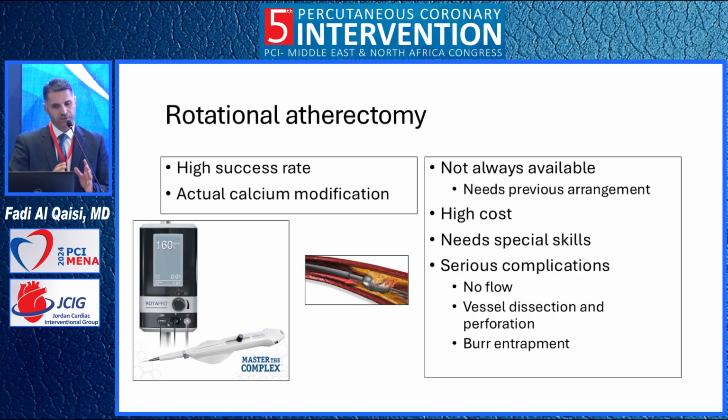What are other equipments? Rotational atherectomy. Rotational atherectomy has the advantage of a very nice success rate. And it's actual modification of the calcium. You are shaving the calcium. It is available in Jordan. It is available, the new generation, the Rota Pro, which is more operator friendly at this time. Unfortunately, this advantage is limited to our own market. It's not always available. You have to have a previous arrangement with the company to bring it to you.